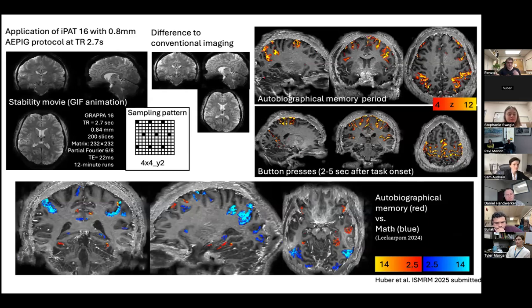And it's counterbalanced with math equations. So you can see the movie time series on the top left. You see some pulsation over there, but you see that the image quality is pretty stable. And here I'm flipping back and forth how it would be with and without EPIC, basically with the third order shim or without the dual polarity while doing all of this.